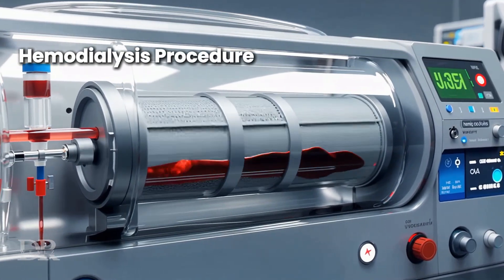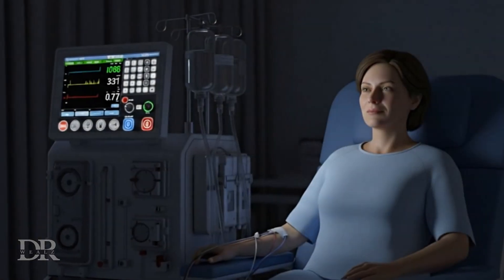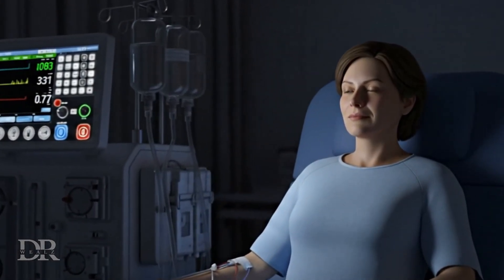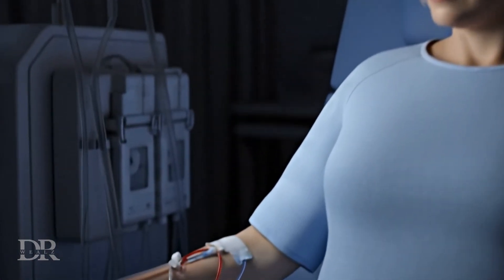Hemodialysis is the most common dialysis method designed to mimic how healthy kidneys filter blood. The process removes waste products, excess fluids, and electrolytes from the blood of patients with kidney failure.